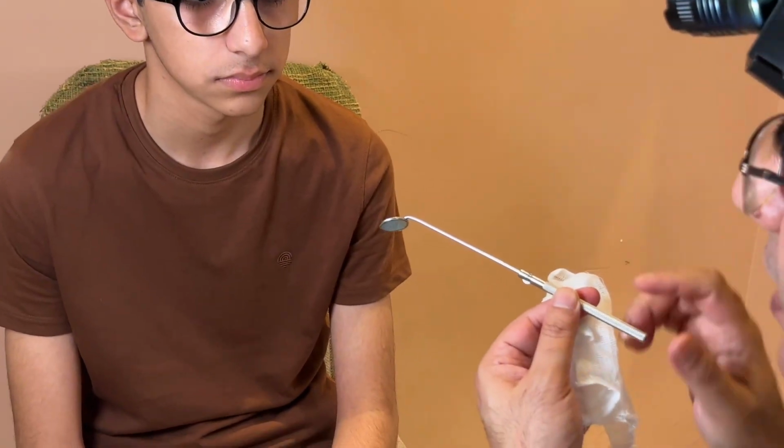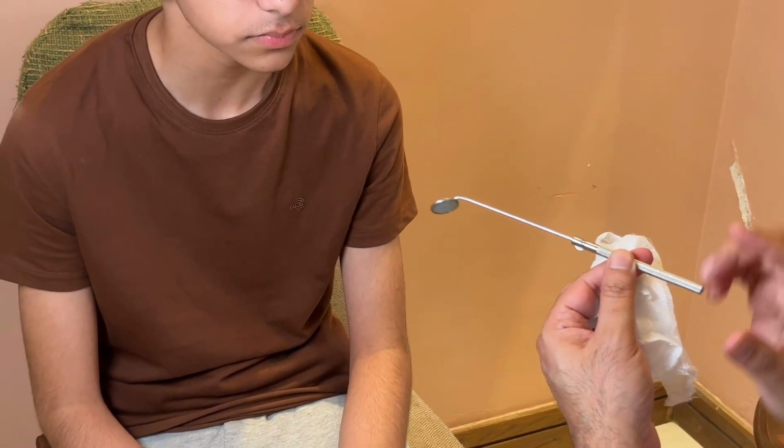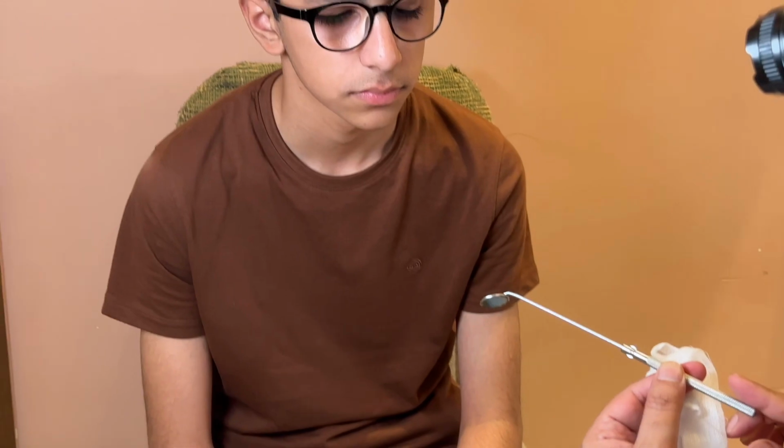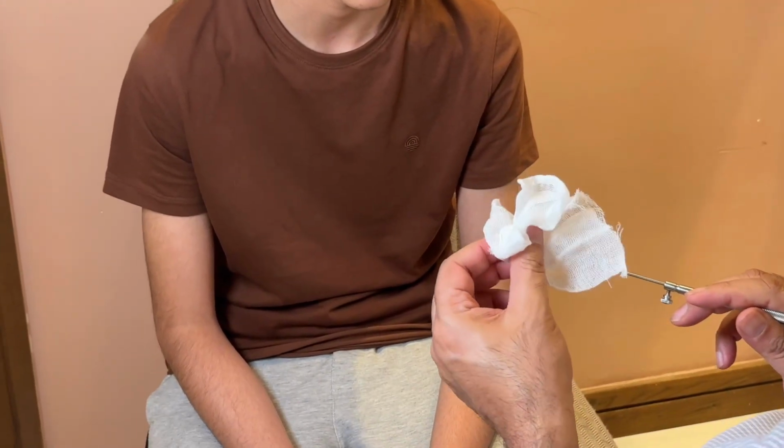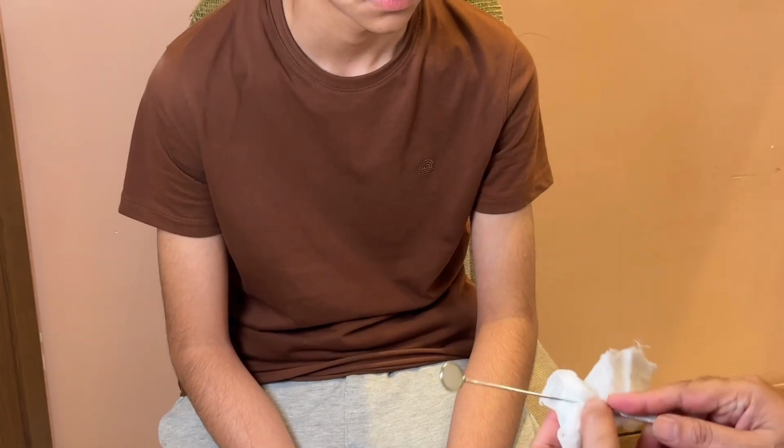So two things we have done while passing it backward, lifting the uvula up. We have checked the laryngopharynx, and by asking the patient to pronounce E, we check the mobility of the vocal cords. So these 2 points are very important while performing indirect laryngoscopy.